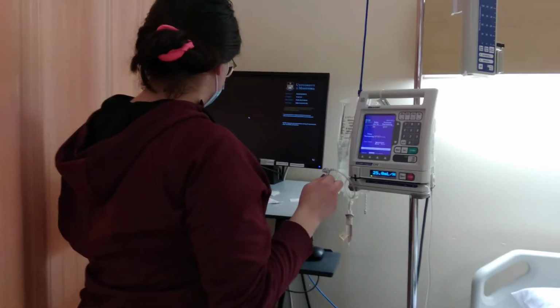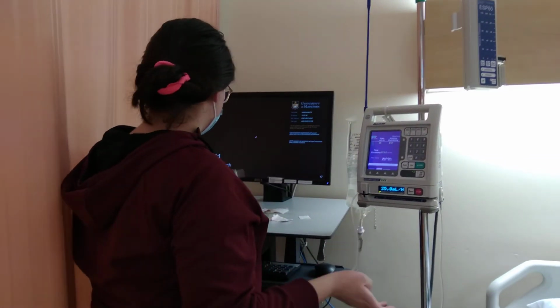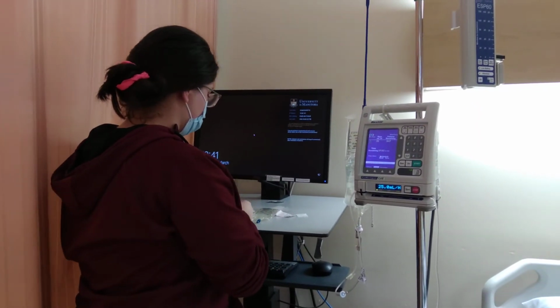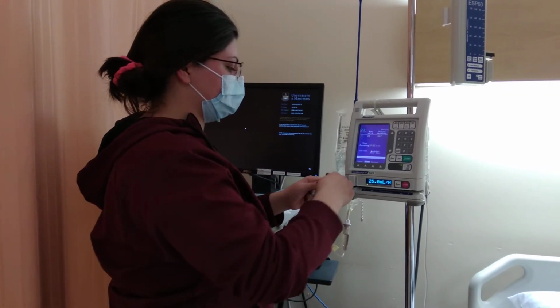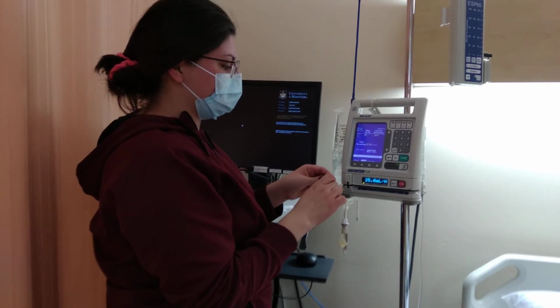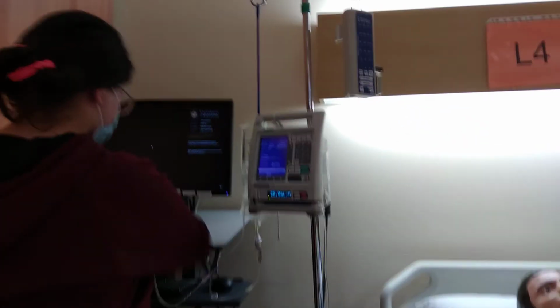So we turned our back, and now we're not sure. So after reviewing my documents, I can go ahead. So swab for 30 seconds, let it dry for 15. I'll pick 100 milliliters. This is sterile to sterile, so it's okay. Then I'll, okay.